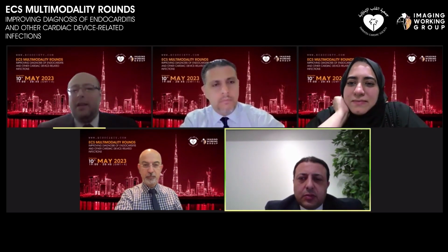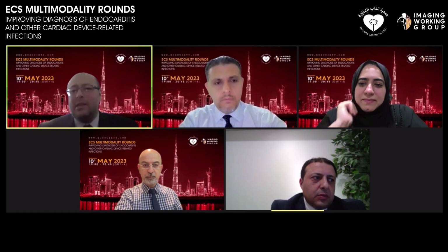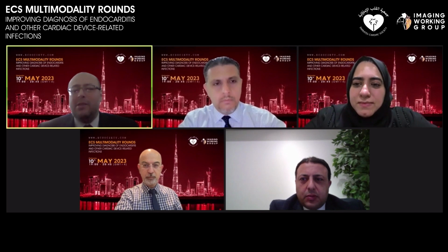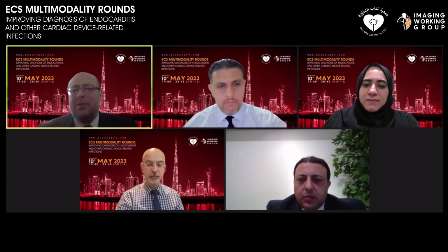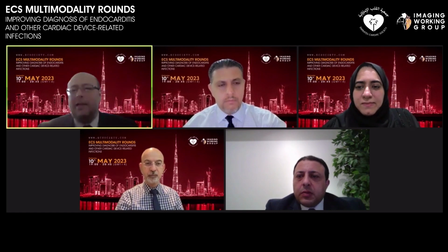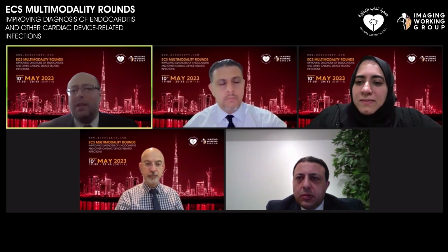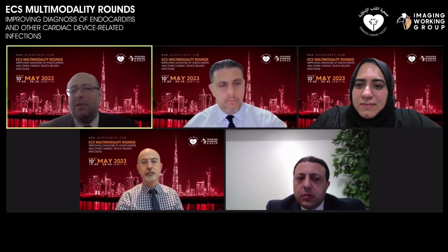On the other end, the timing is really helpful. I would also recommend a non-contrast study in the beginning, and usually I try to gather a quick low dose immediately after. Sometimes if there is a pseudo aneurysm or something, it may end up filling late. So not knowing obviously what you're going to see, but if you know the patient, you've known their TEE, you know what to look for.